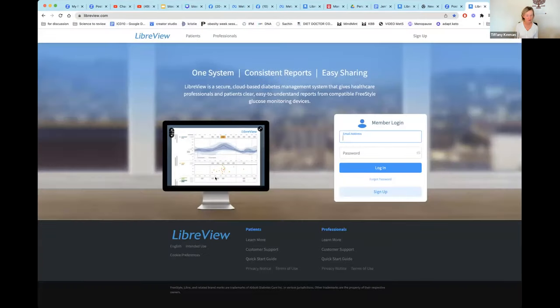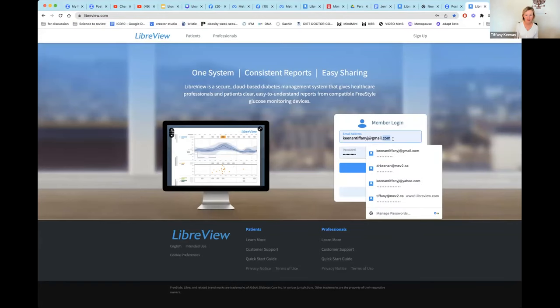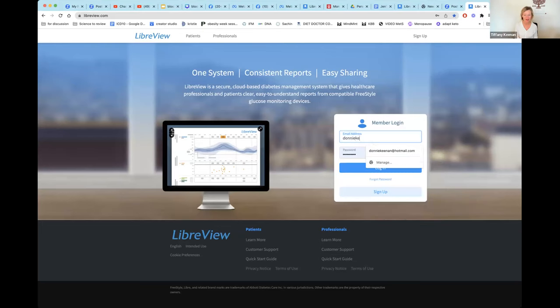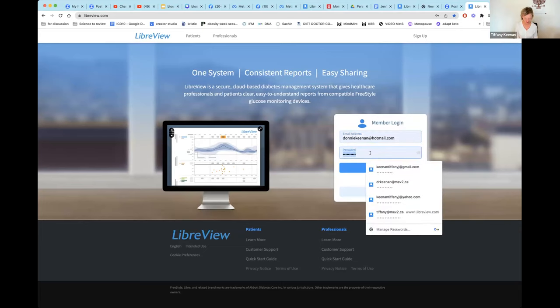I'm at libreview.com. I have to create a new account because that's the only way I can show you the steps — I'm going to see if I can make an account for my father.